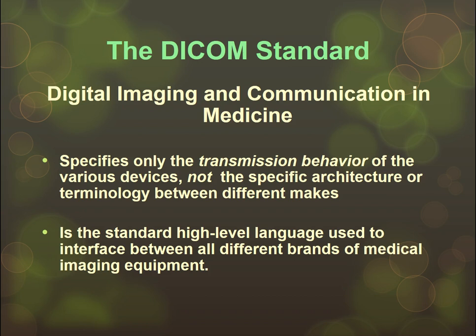So the DICOM Standard stands for Digital Imaging and Communication in Medicine. It specifies only the transmission behavior of the various devices, not the specific architecture or terminology between different makes. And what that means is it is a transfer protocol. It is an image format, just like JPEG, bitmap, and things like that, but it's also a transmission protocol. And we'll talk about protocols a little bit later. So it determines how the two devices talk together, kind of like I talked about between the SCU and the SCP. It's the standard high-level language used to interface between all different brands of medical imaging equipment.